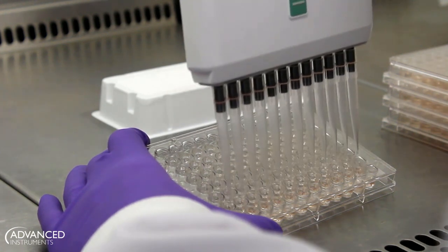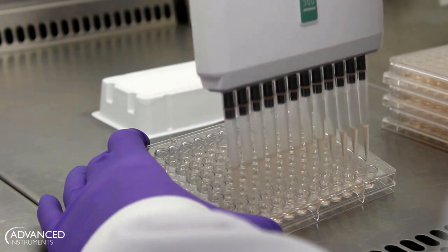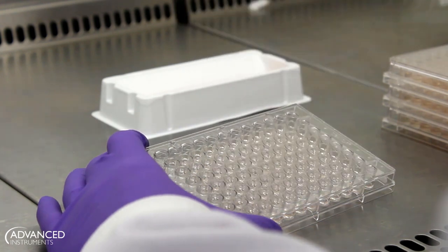From day 4 through to day 10, all plates should receive a full medium change with stem cell growth medium alone.